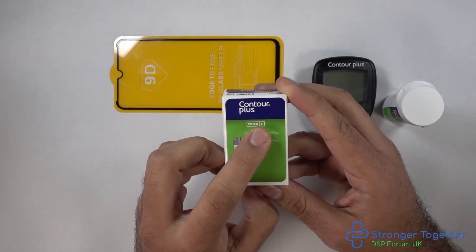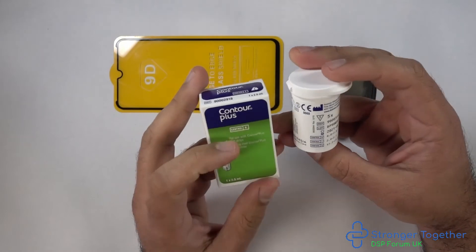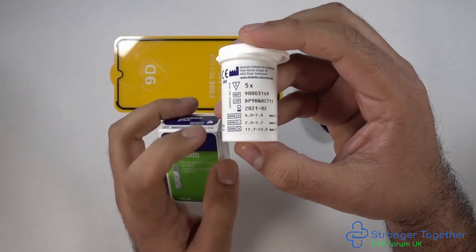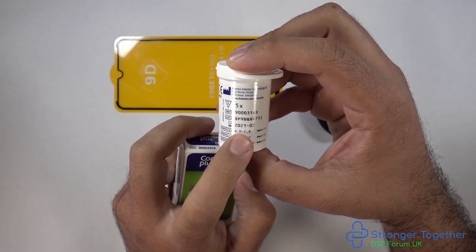Take your test strips and make sure they are actually for your Contour Plus machine. Check the expiry date. If we look on the side of the pot it says Control N, L and H. In this instance our control solution is N, so we should get a reading between 6 and 7.8 millimoles per litre.